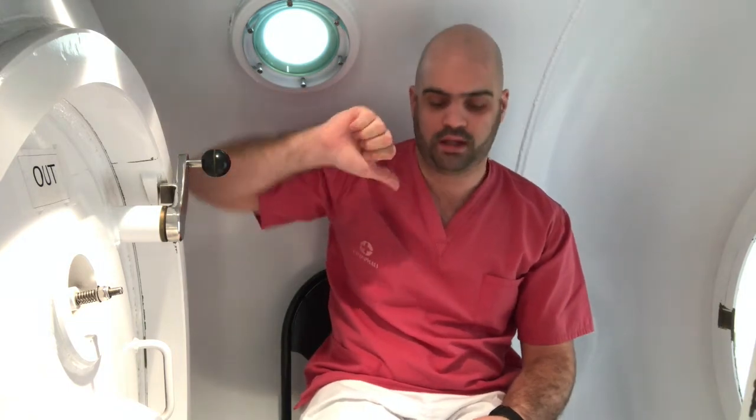Then we have another sign that looks like this, and it means go deeper or increase the pressure. In this chamber in Iceland, we talk about depth, because all the gauges are in meters of salt water, and we talk about going deeper or going shallower. So this sign will mean go deeper. This sign will mean go shallower, or go to the surface, or decrease the pressure.